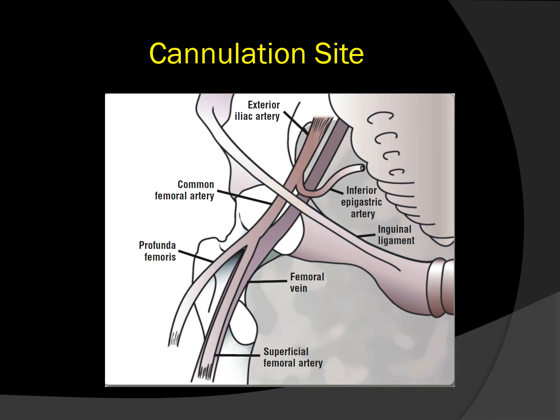Cannulation for intra-aortic balloon pump typically occurs through a sheath, roughly 7 to 8 French size, that's inserted into the common femoral artery below the inguinal ligament but above the bifurcation. As you can see in this illustration, that is the perfect location because it is above the bone of the femoral head.